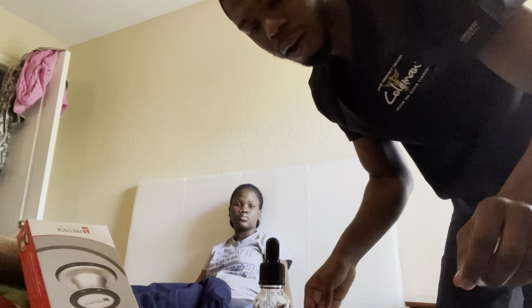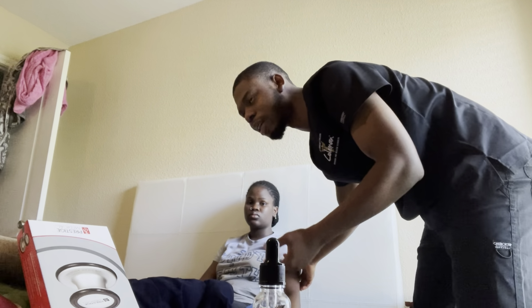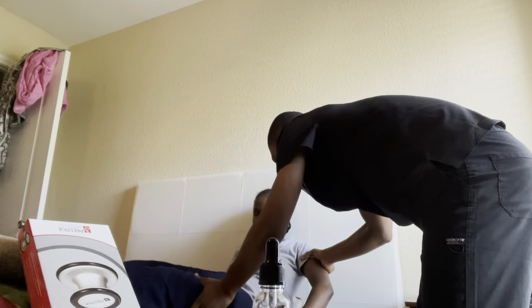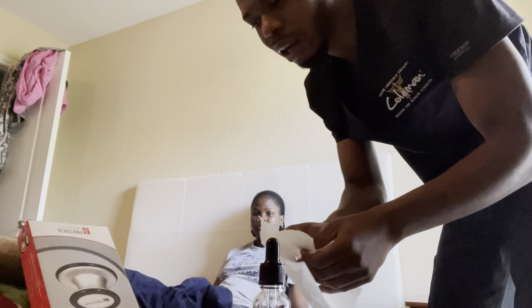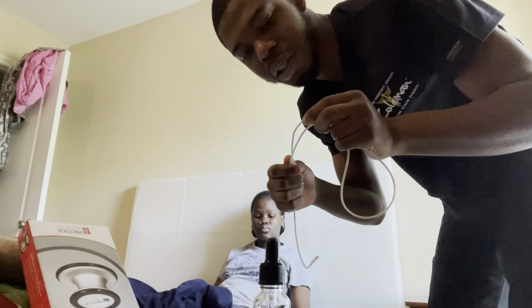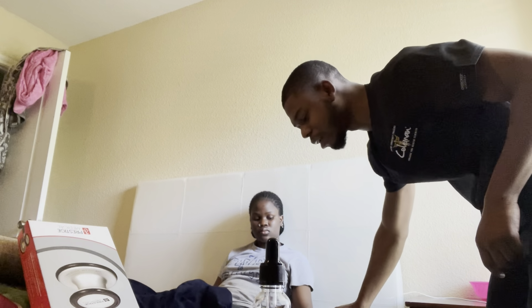After that, I will place the patient in a comfortable sitting position or a semi-Fowler position. Are you comfortable right now? Yes. Then, after that, I will take my suctioning tubing. I will connect it to the suctioning machine, and I will turn on the suctioning machine, and I will place the other end of the suctioning tubing by the patient's bedside.